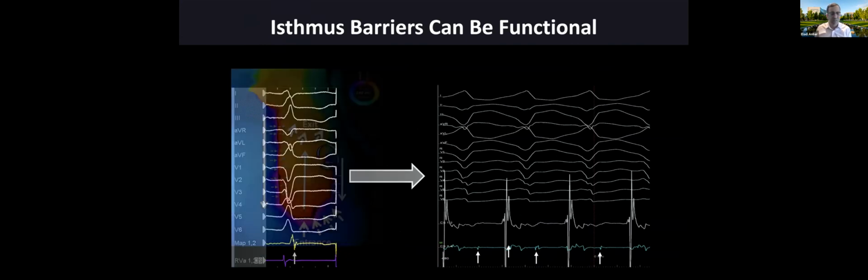Okay. Now, you all know this, right? This is not so surprising. During sinus rhythm, you may have something that looks fairly normal, maybe a little bit of a LAVA, and all of a sudden you pace and it becomes a late potential. And this late potential can become the isthmus of your VT, but you could not recognize it in sinus.